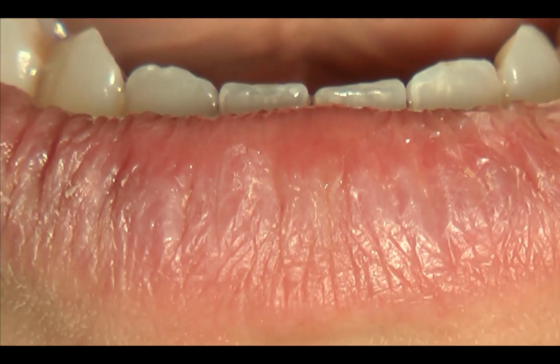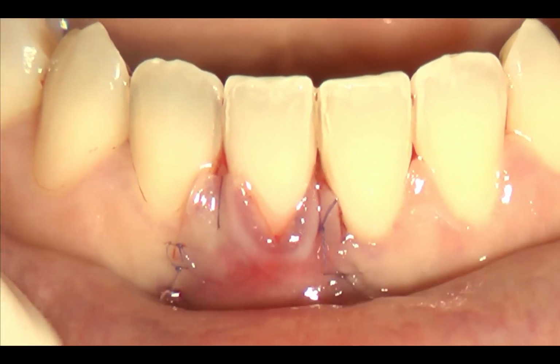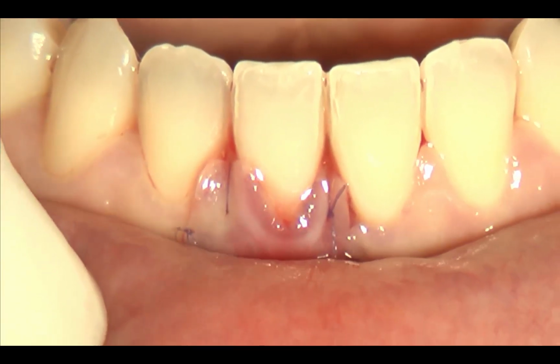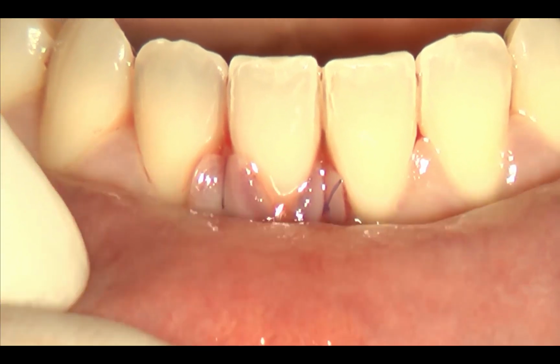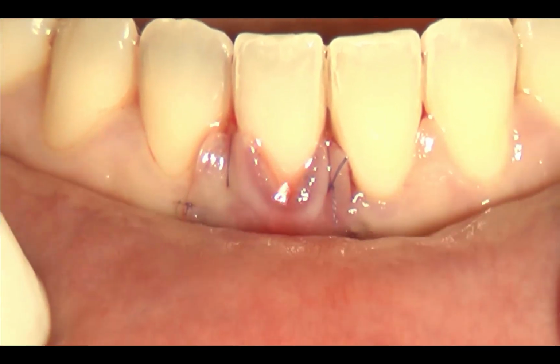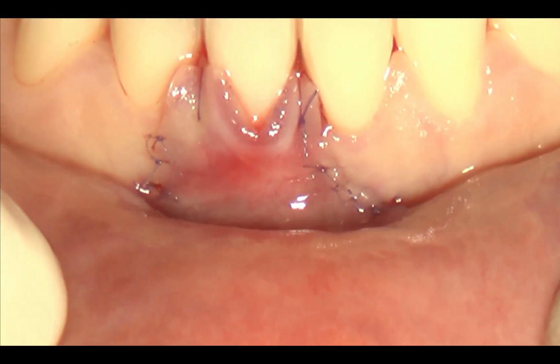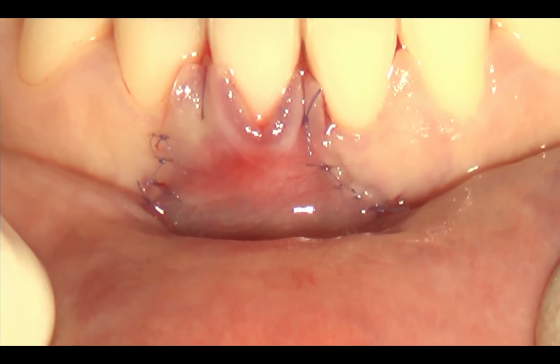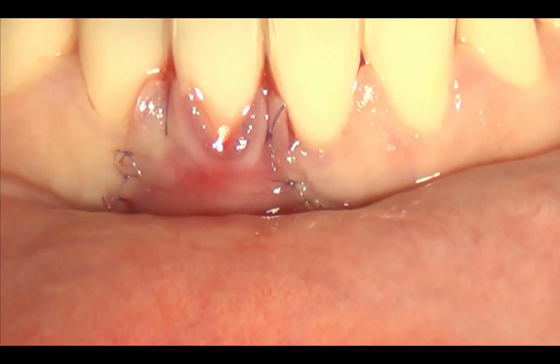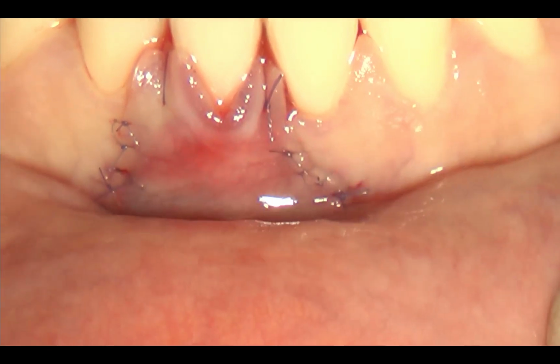And with the same papilla in position like this, like we did before, you see that there is some bleeding getting out from the soft tissue margin. You see it? So it means that the coagulum will not be stable. It means that we have to repeat now, that everything is perfectly stable, the first suture in order to fix the keratinized tissue to the convexity of the clinical crown and give stability. Look how much liquid is getting out when I pull the lip from the soft tissue margin.